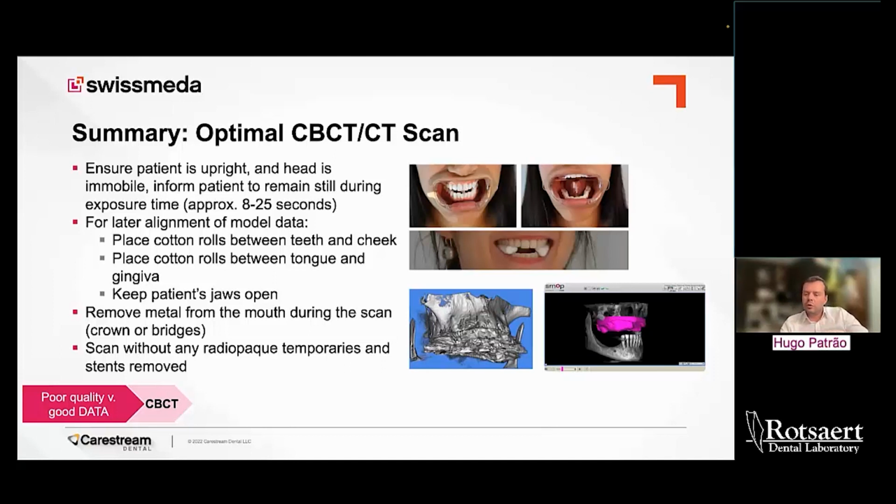It's not something to be rushed. Your intraoral scan also needs to be of a nice quality, because if you don't have good data from the beginning, you cannot expect to get a good guide, an accurate procedure, and an accurate outcome, just because the original data was not correct, okay?